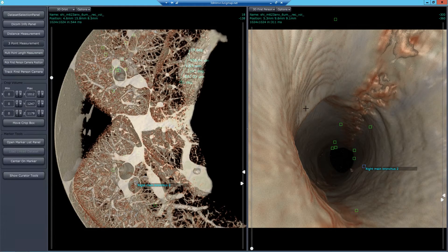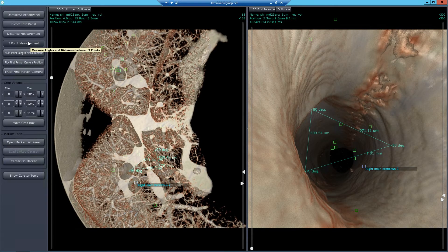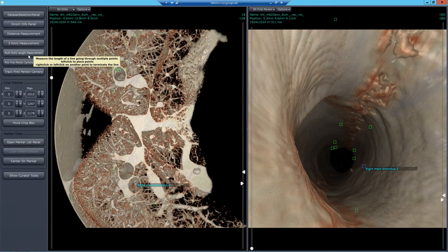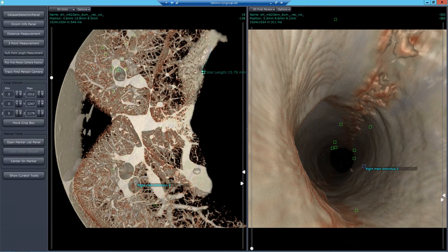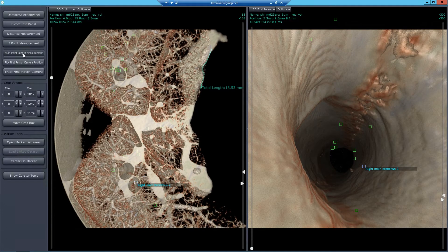Sometimes we want a three-point measurement. We click and click and then there's the third measurement. We turn it off to delete the measurements. Then there's the multi-point measurement. There are times when we want to measure something that's not a straight line — to get a better idea of the exact distance. We can just click point to point to point, and it gives us an overall measurement. We could go into an even smaller space and work in more detail. We turn that one off as well.